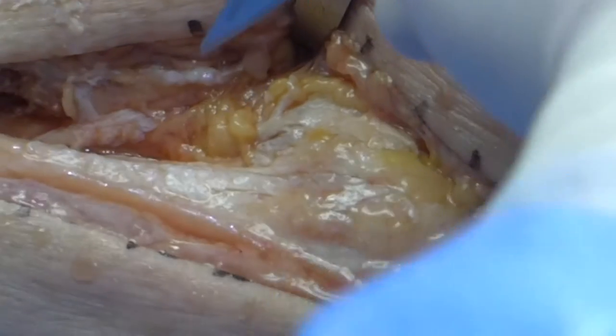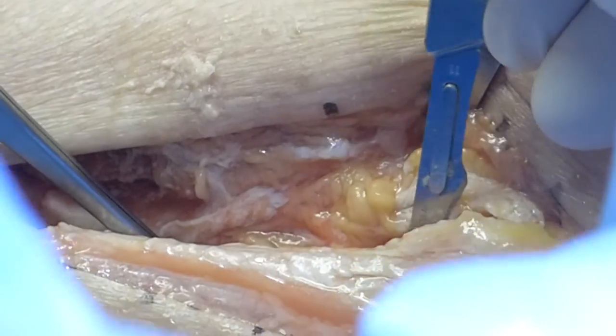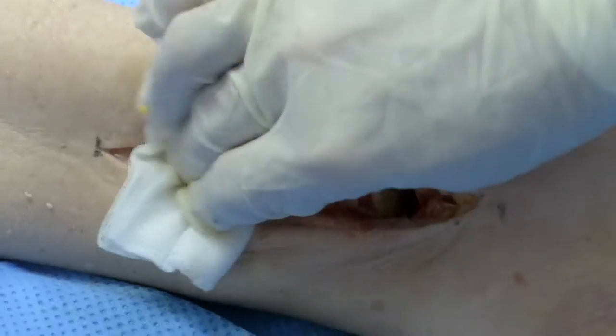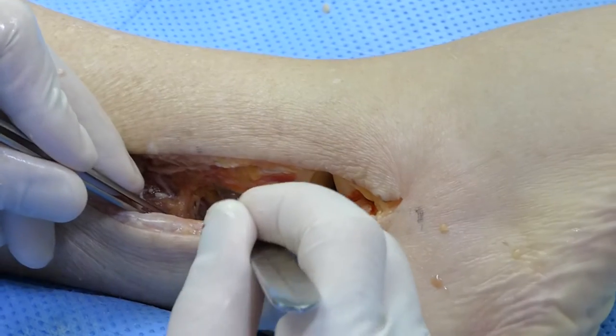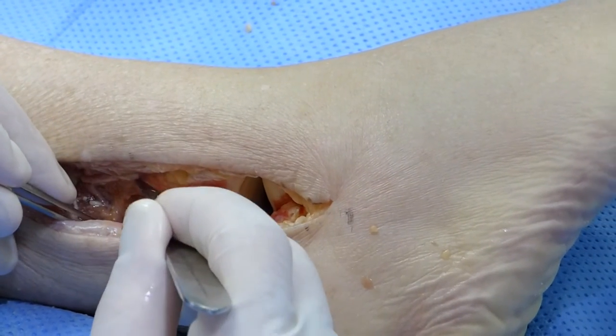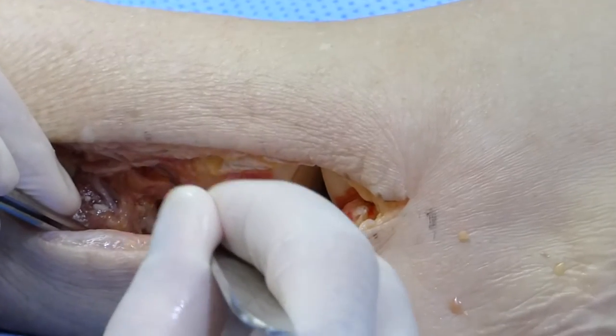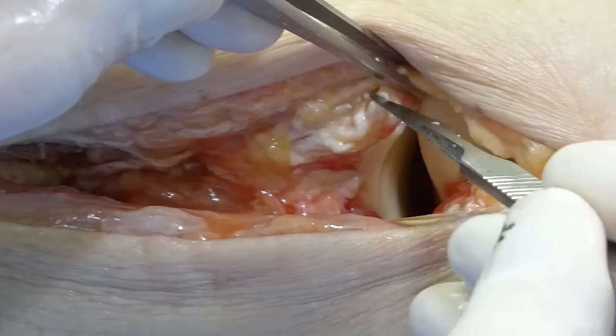Once the fibula has been resected, careful haemostasis should be performed to make sure that the branch of the peroneal artery to flexor hallucis longus is controlled. If the intention is to utilise a home run screw, sticking close to the posterior malleolus, the soft tissues can be elevated to allow access to the posterior surface of the distal tibia.